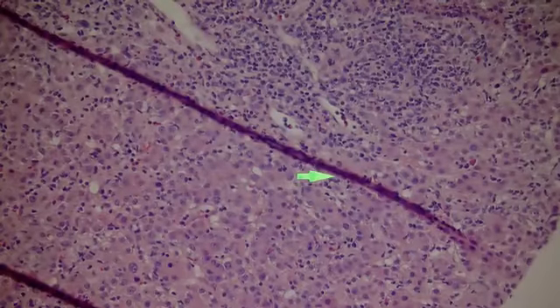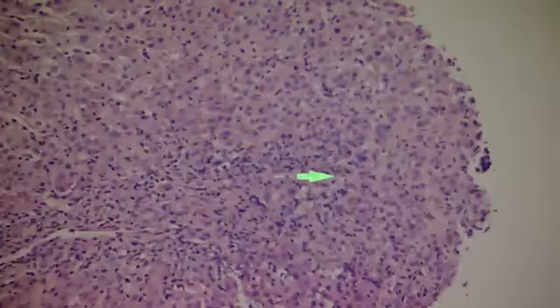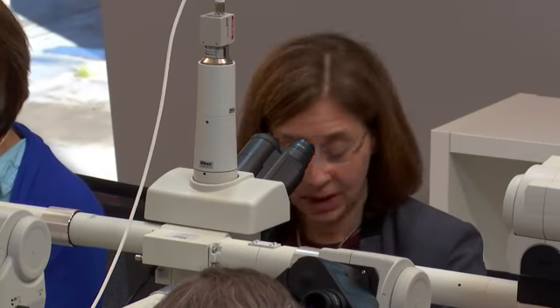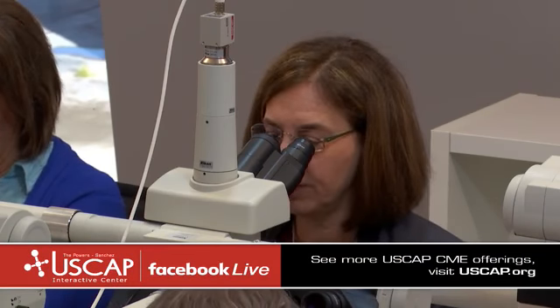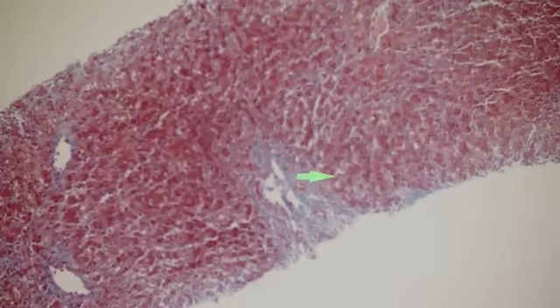So what's everybody's differential? Same. But you were given the ANA. So she's got an ANA of 320. So this is autoimmune, and like I said, autoimmune typically is an acute on chronic, but this one was a pure fulminant. And as you look at this trichrome, the trichrome may help you, and you've got the capsule here. So that's kind of your clue for what a nice dark trichrome would be, that would be fibrosis. And again, this is all much wimpier.